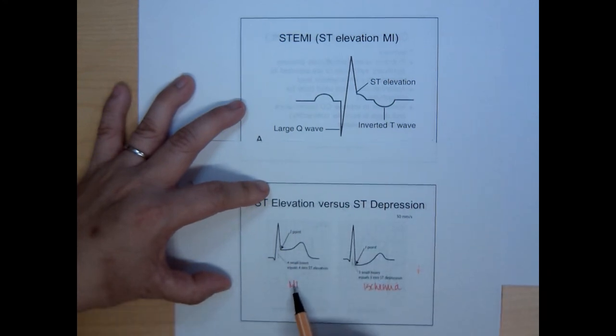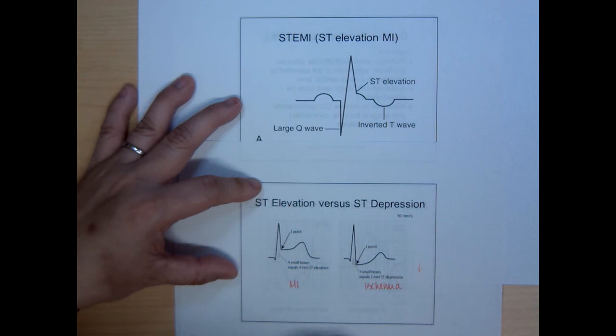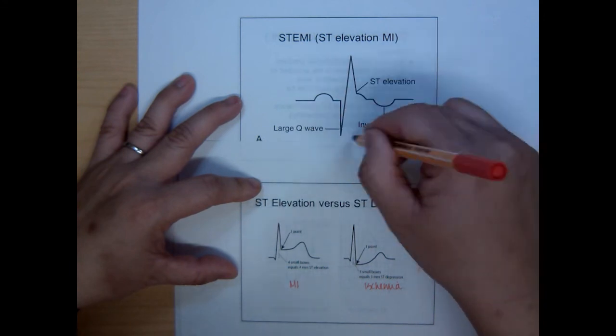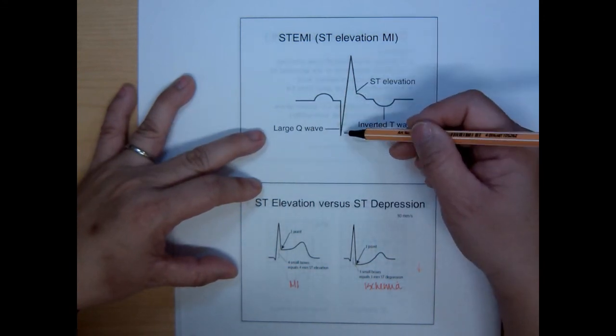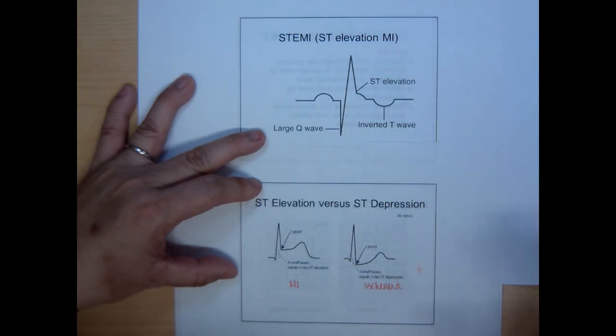They would have to reperfuse the area, either through thrombolytics or by taking them to the angiogram and opening up the vessel. Understand though that with ischemia, especially when you see inverted T waves like that, these are permanent changes that are set in, like the Q waves. They will still show up after a permanent MI that's gone all the way through the wall.